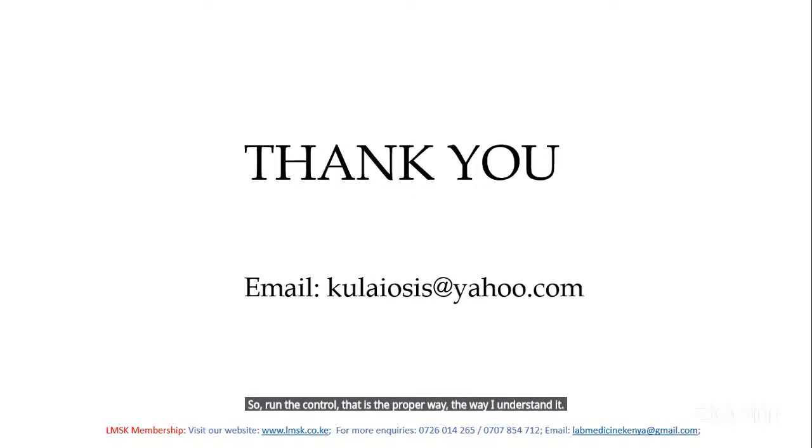Run the control, let the control pass before you do any test, because if the control have not passed, then all what will be done thereafter for the patient, those are wrong results, inaccurate results. That's how I will frame it. Thank you.